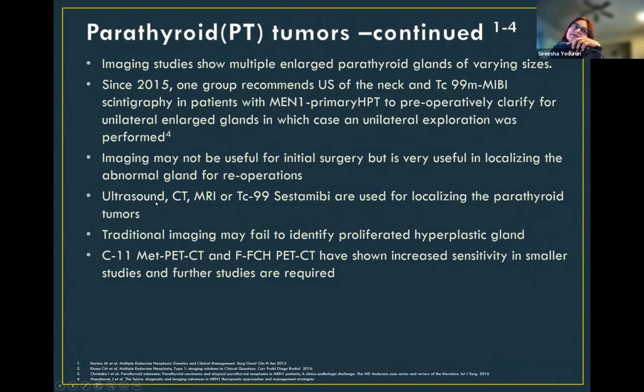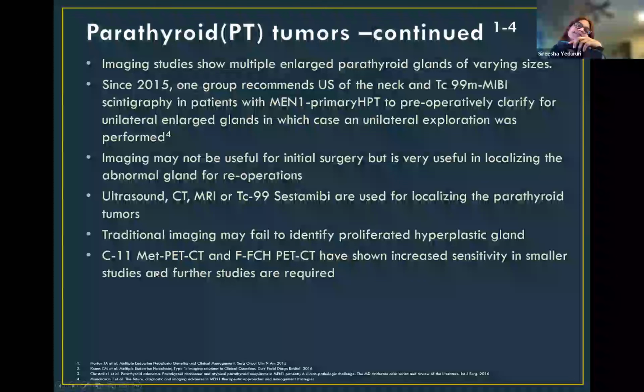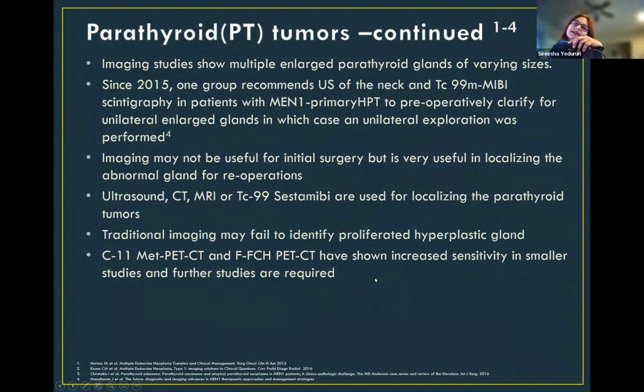And again, ultrasound, CT, MRI, or technetium 99 sestamibi may all be the tests. And sometimes, in spite of doing all this, our imaging studies may fail to identify these proliferated, hyperplastic glands. And then there are newer studies that have been increasingly used.